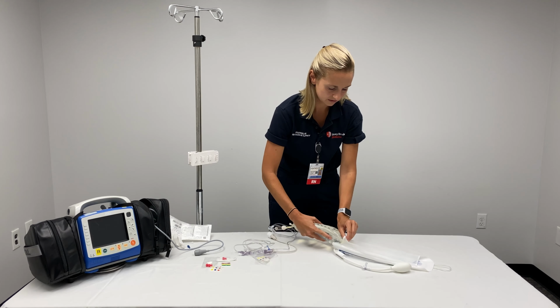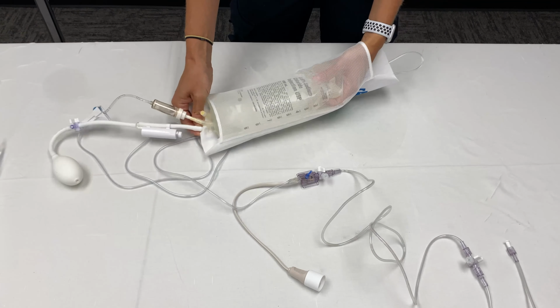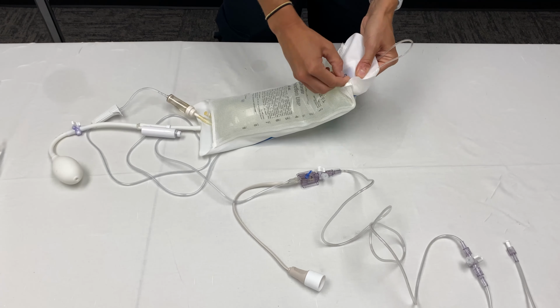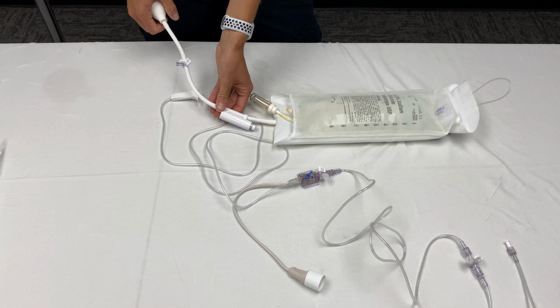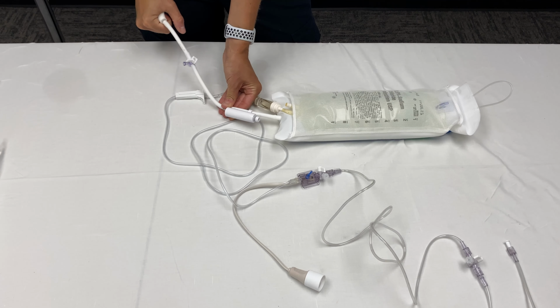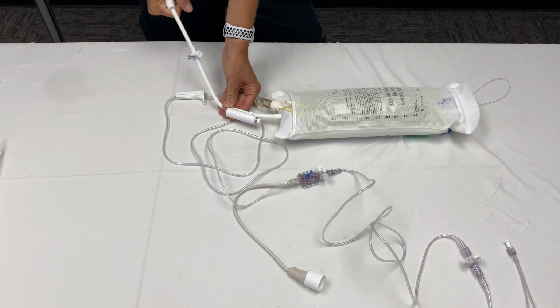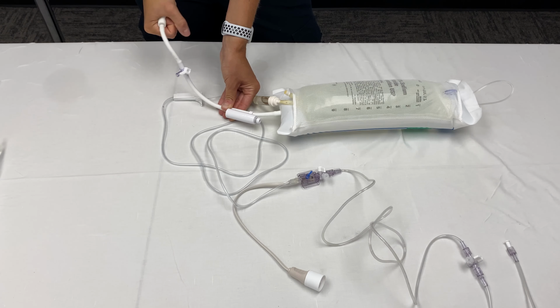Next, you're going to stick the liter bag into your pressure bag, and hook it inside the pressure bag on the hook. Pull it down to make sure it's secure. And then you're going to pump up the pressure in your dial to 300 millimeters of mercury, which will be the green zone. Sometimes I'll go a little bit past, just until you see the red, so that when you flush your line, you lose a little bit of pressure and it's still in the green.